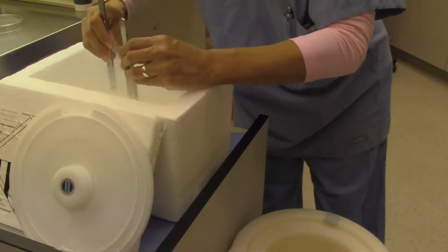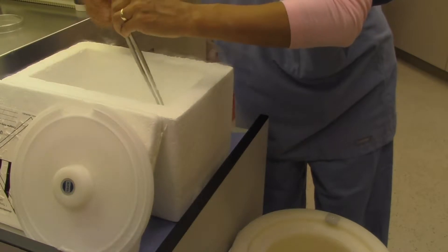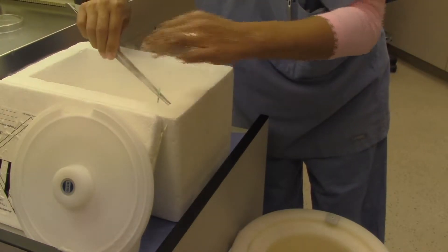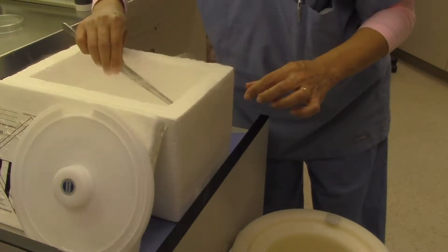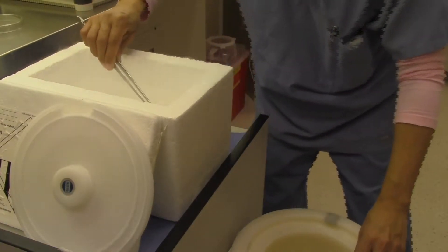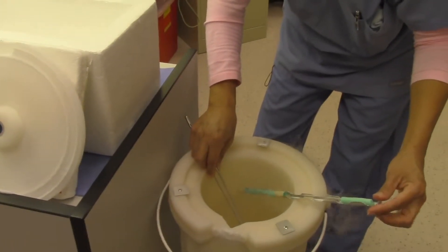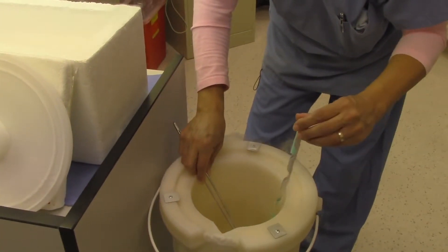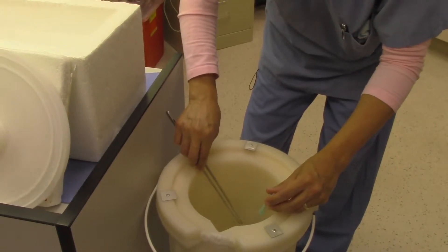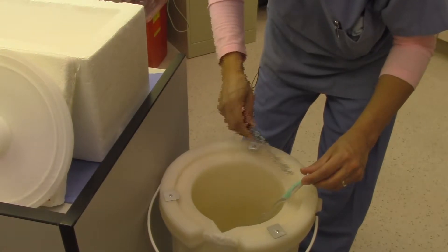With vitrification you have to be very careful to keep the straws under liquid nitrogen, because the eggs are frozen in such a tiny bit of residual media that they can thaw instantaneously. We have a cane with the patient's name and a goblet full of liquid nitrogen, so when we put the straw in the goblet it's always maintained in liquid nitrogen.